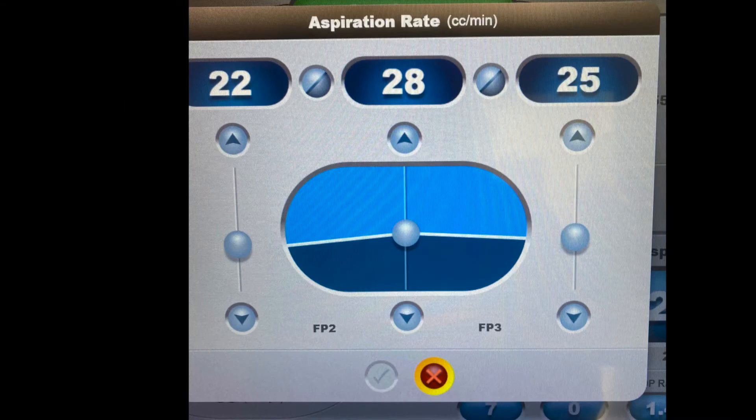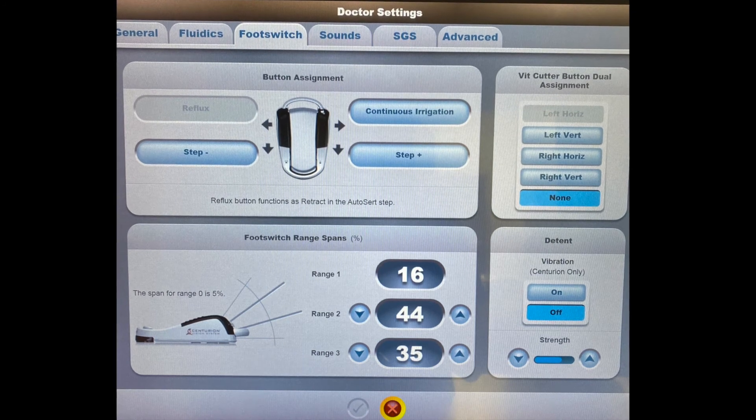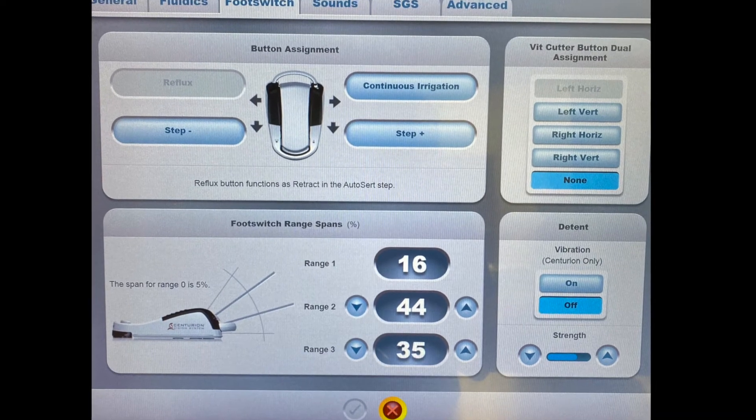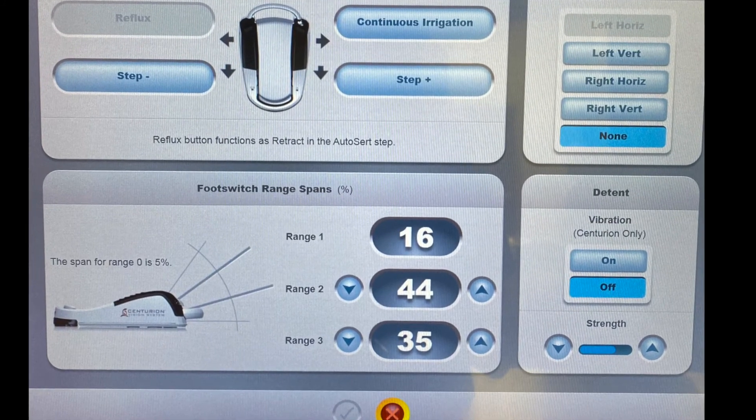This next picture demonstrates how you can change your settings—this is aspiration flow between foot position two and three, and you can see how you can manipulate how the aspiration will build and how it will flatten out. I have spent hours meeting with the company equipment representatives to understand how these settings can be manipulated to benefit me during the sculpt part of cataract surgery. I also set the foot pedal so that the range from two to three has the greatest percentage, as this is where I'm working during sculpt mode to control how much FACO energy is delivered and the level of aspiration.